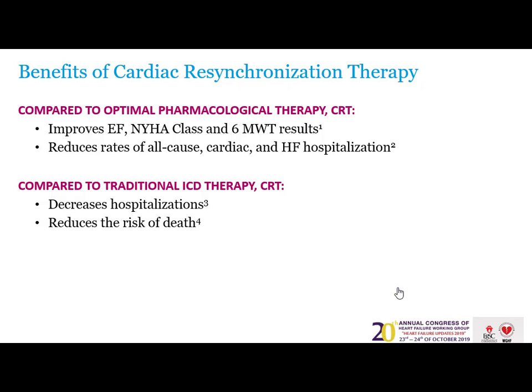We'll go to the benefits of CRT compared to optimal pharmacological therapy, improving ejection fraction, NYHA class, and 6-minute walk test. And I stress to the fellows, you have to have the 6-minute walk test as an objective, not subjective, measure, because in different cultures, people complain differently. I don't know what they do in Europe, but in Egypt, the patient likes to complain more and more, so that she gets the utmost attention of the doctor. So, if you get this kind of patient, which is about 80% of the patients I see in my clinic, you have to have an objective test.